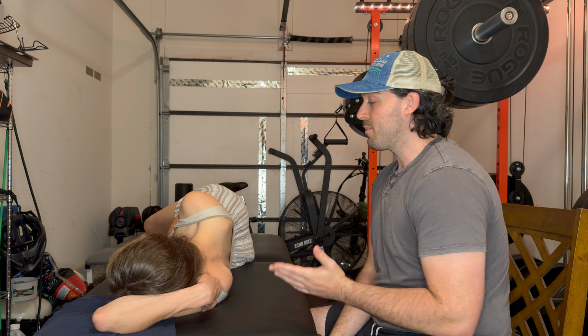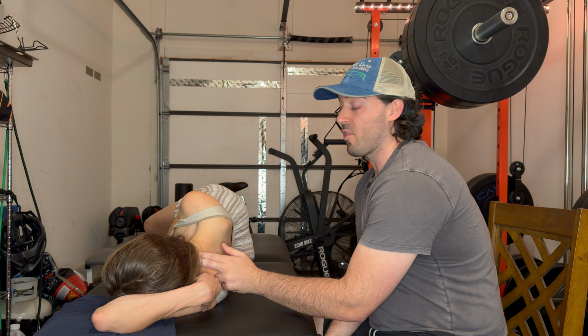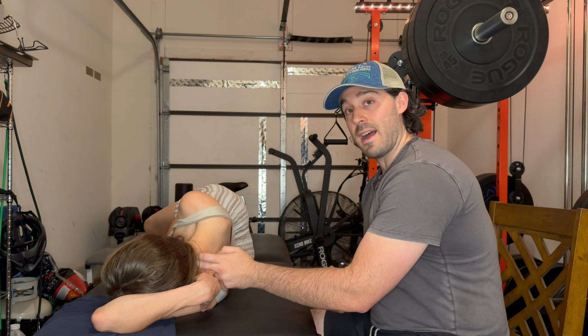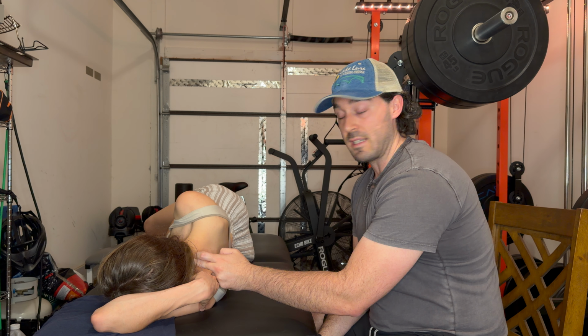One of my favorite things to do when needling the levator scapula is, again, we want to make sure that we look at the anatomical landmarks. As we look in the cervical spine, we look for the spinous processes. So again, the first cervical spinous process does not have a major point that we can palpate. But once we roll down on it, I can find the level of C2 here.